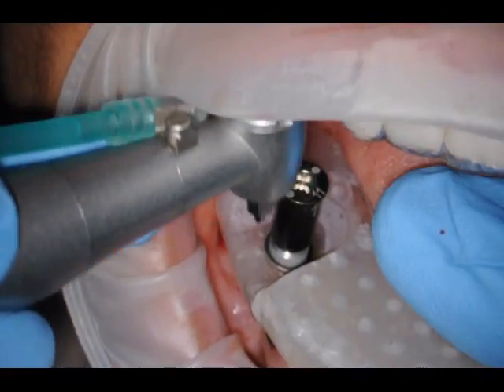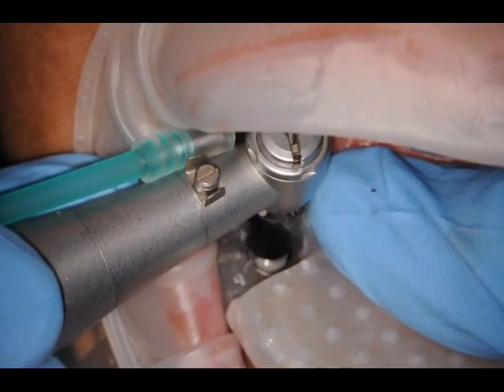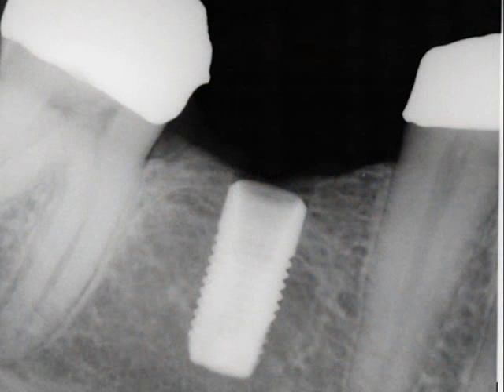So I go through a subsequent set of drills that expand the site, and then I go in and place the implant. Here you see the implant that's attached to what's called an implant holder, and I slowly drive that into the area that I created for the implant. And here you can see the final X-ray. It's precisely positioned where I had planned initially.